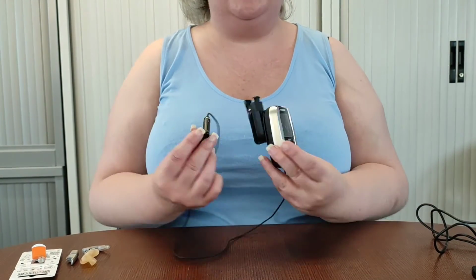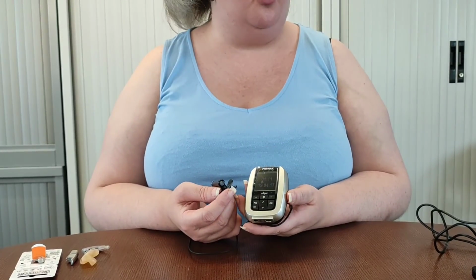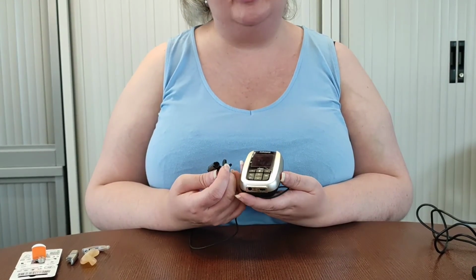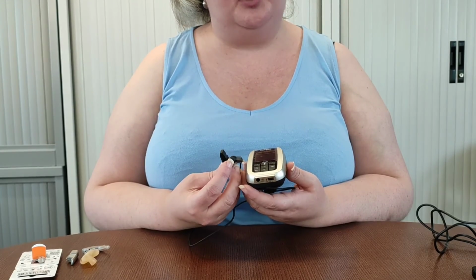Now, I would say that if you can, please promote the young person themselves to put this on charge at the end of every day, but it might be that they need some adult supervision to make sure that happens.